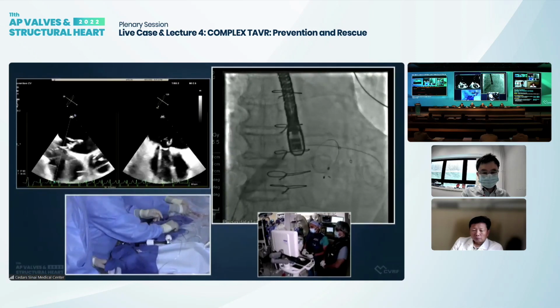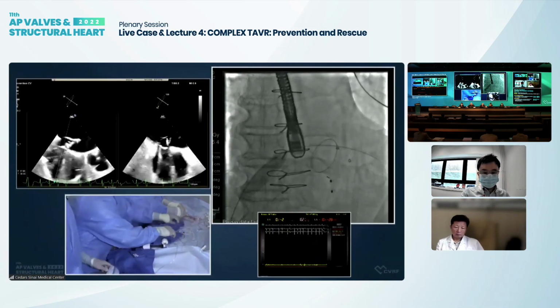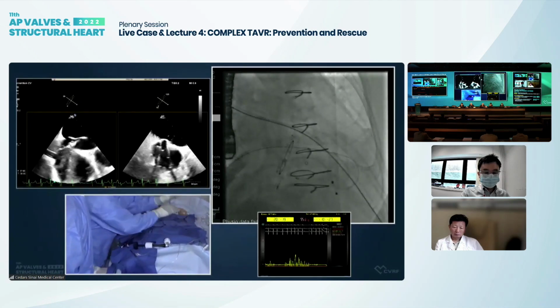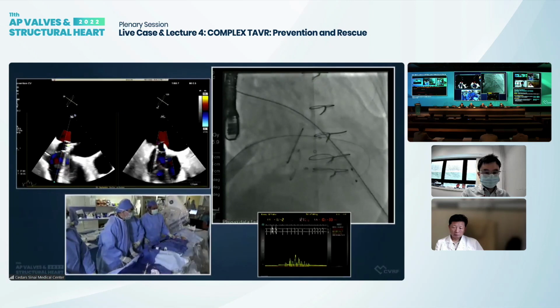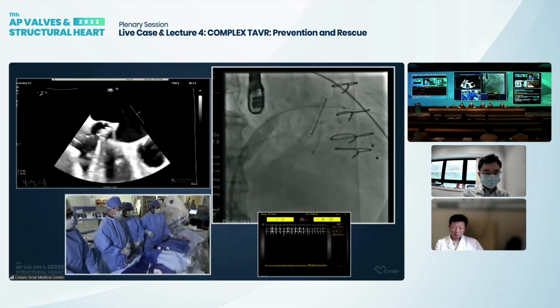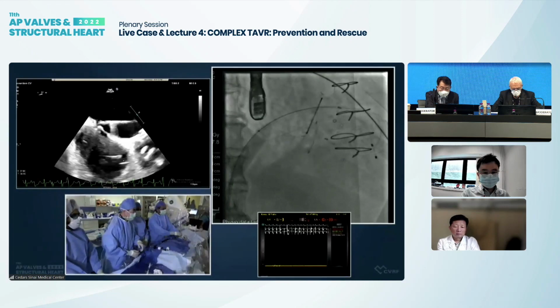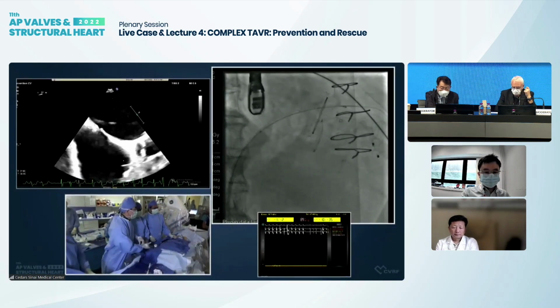Yeah, do the tricuspid. So there is a tricuspid ring that this patient has. Should we test that pacer? All right. Can you test the pacemaker, please? No, there are people who deploy mitral valves, do valve in valves without actually rapid pacing. I don't know, but we tend to use it. I think it's capturing. It's just a little tacky. Too fast. Good. All right, I think we can come down now, guys.